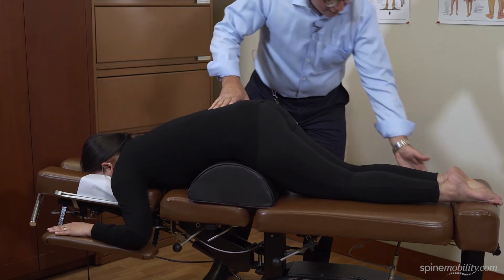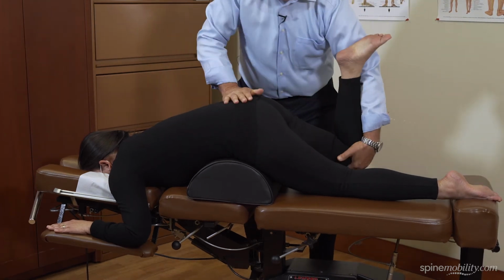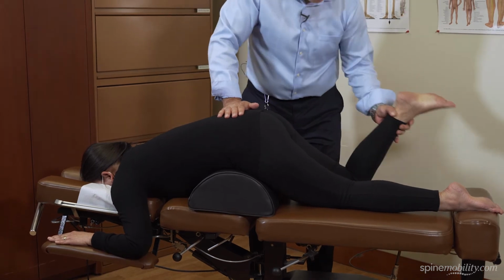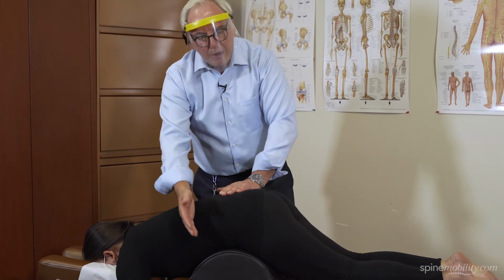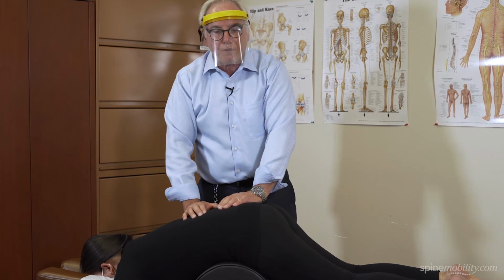We can also stretch the gluteal muscles. We can also stretch the iliopsoas, which also, when it's tight, introduces extension. All these maneuvers are outlined in our bootcamp protocol, but the bolster, again, helps to facilitate flexion and helps you maneuver the patients without aggravating their symptoms, and also helps facilitate intersegmental flexion.